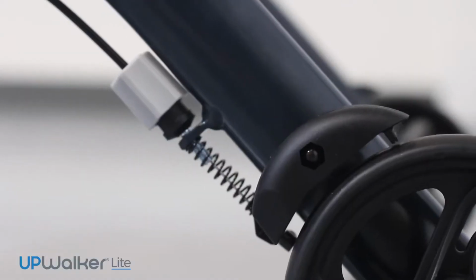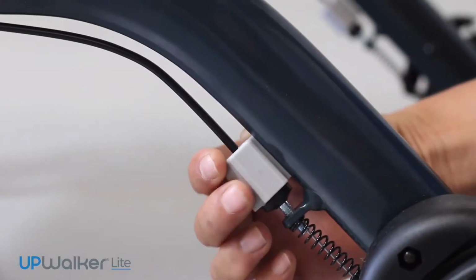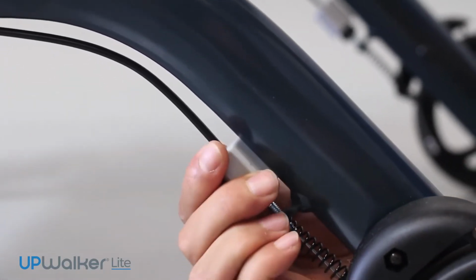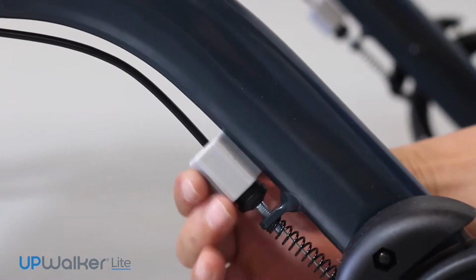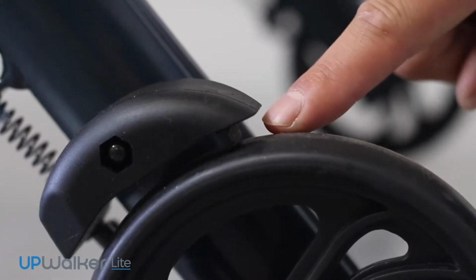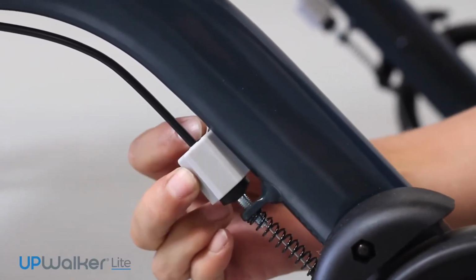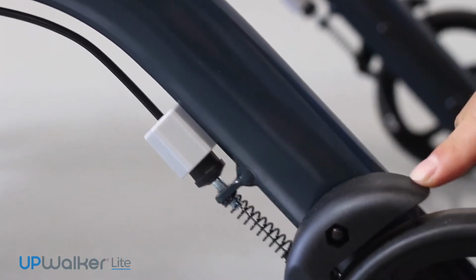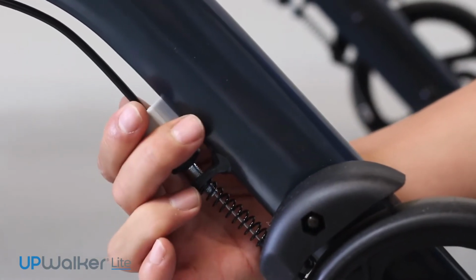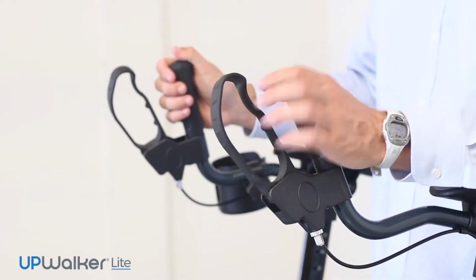To tighten the brakes if too loose, locating this gray screw knob under the frame near the rear wheel, press the knob downwards and turn to the left, counterclockwise, a half rotation at a time until desired tightness is reached. To loosen the brakes if too tight, press the gray knob downwards and turn to the right, clockwise, until desired tightness is reached. Always ensure the parking brake is disengaged when adjusting the brakes.